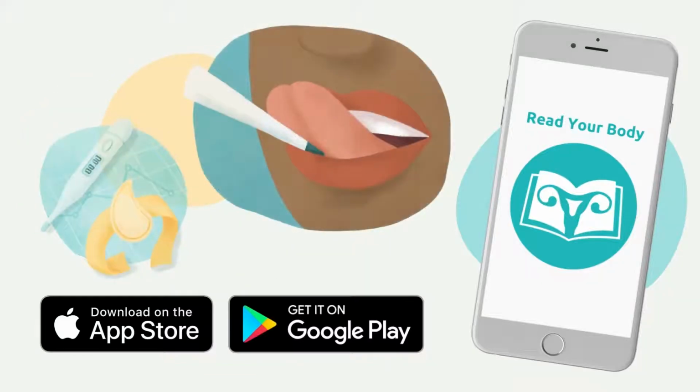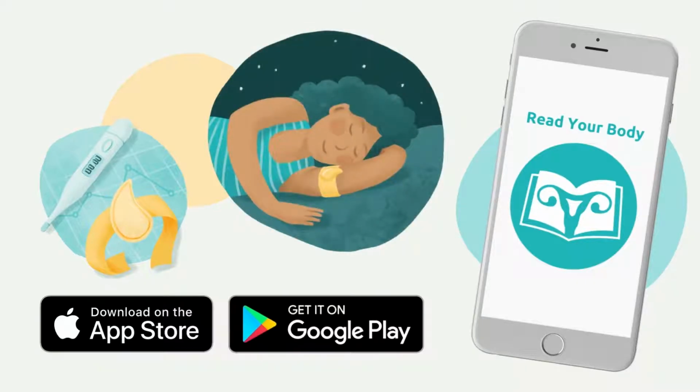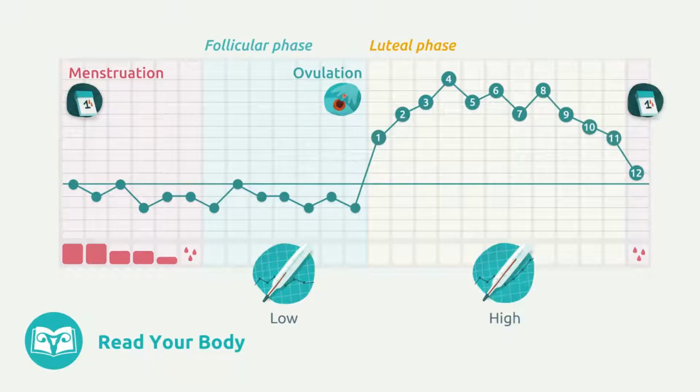Temperature is an easy biomarker to track. Simply take a daily reading using a basal body thermometer under your tongue immediately when you wake up, or by wearing a Tempdrop armband while you sleep. Temperature sits at a lower level before ovulation and rises to a higher level after ovulation. A sustained rise, typically confirmed by 3 high temperatures after 6 lower temperatures, indicates that ovulation has happened.